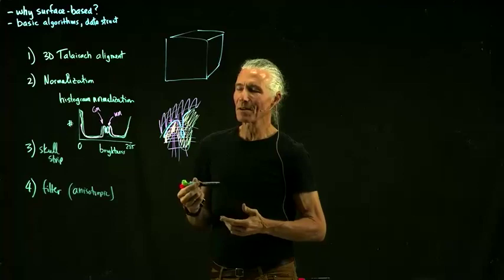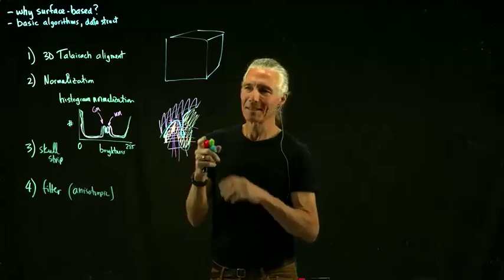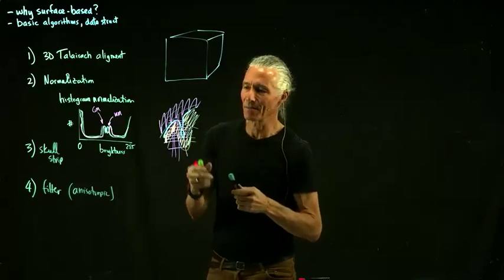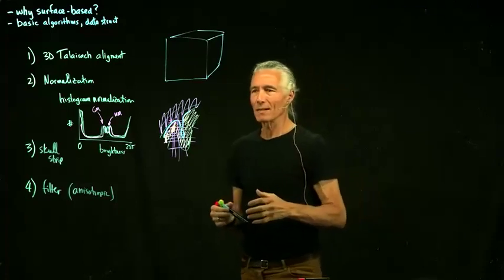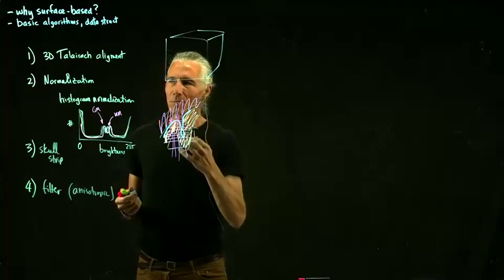It turns out, if you only had like 10 of those, you could fix it by hand. But what if you had like 10,000 of those? It's just impossible. It takes too much time to go through the 16 million voxel data set and fix it. So you actually have to get rid of those things. One way of doing it is to smooth the data set.